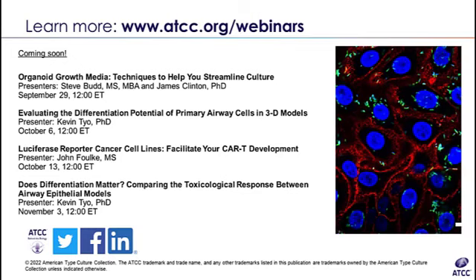Yeah. And one thing to note, heat inactivation can degrade some of the growth factors and components that cells need, the whole reason why you need the FBS in the first place. So it can have a negative impact on the growth factors and reagents in the FBS. So we definitely avoid using it unless it's specifically called for. But cell lines will have that specifically labeled on their webpage if they need heat inactivated FBS, or heat inactivated serum for that matter. Yeah, exactly.